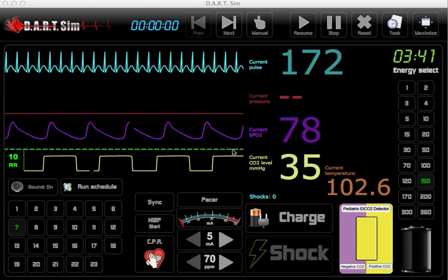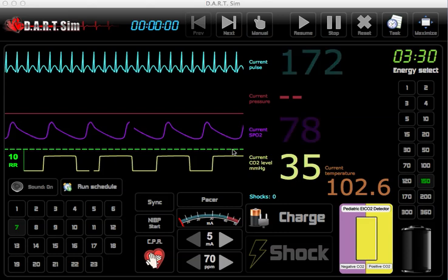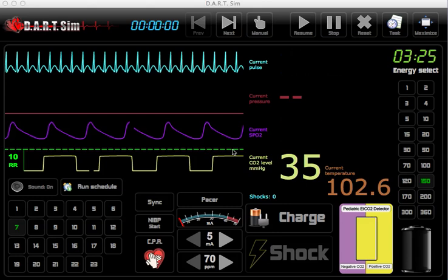Hello and welcome to Dart Sim, the simulator that turns your Mac, iPad, PC, all-in-one touch screen computer or touch screen monitor into a rhythm simulator and a cardiac monitor defibrillator. Let's go ahead and get started with our first scenario.